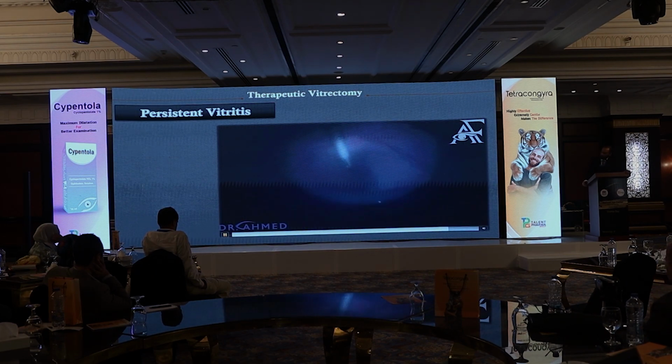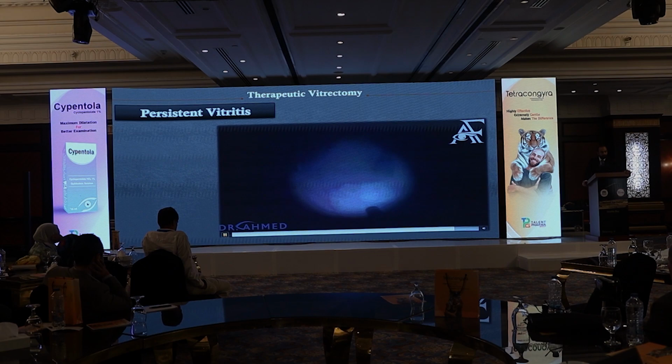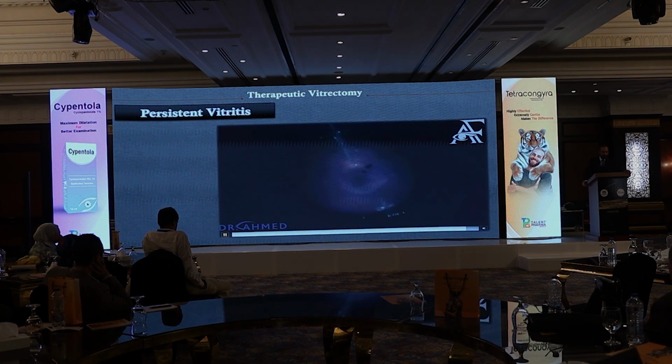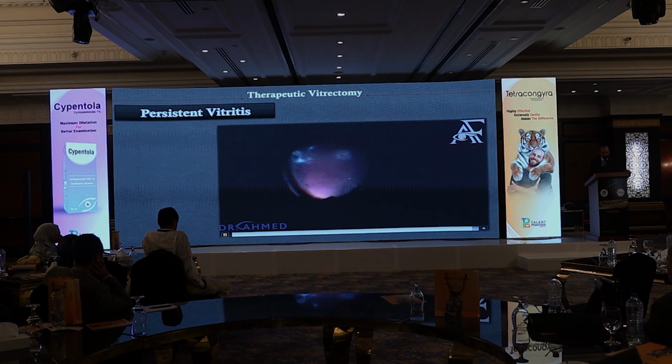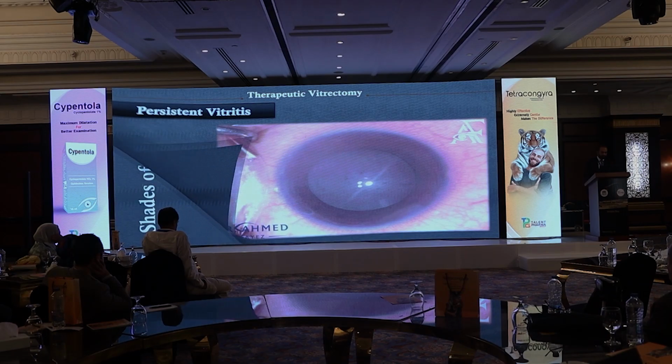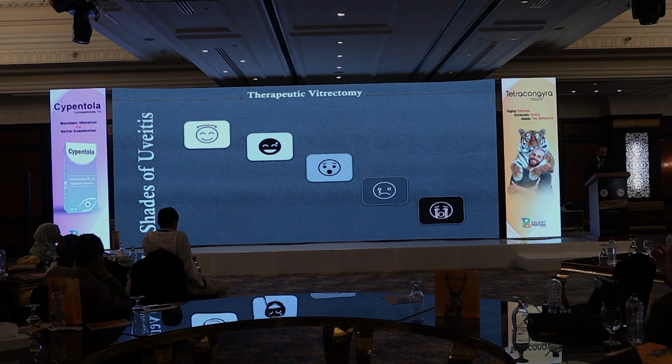Because it is a chronic inflammation, we did foveal sparing ILM peeling, and after that we turned into gas and did some laser for the operation, and we finished. Okay, let's dig a little deeper.